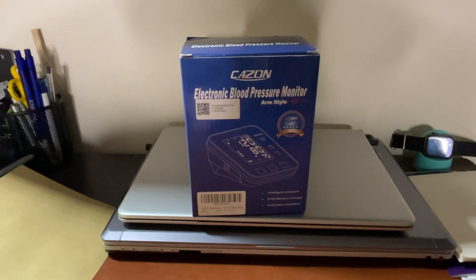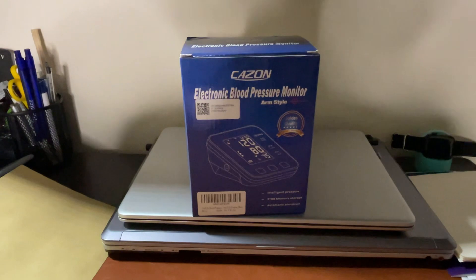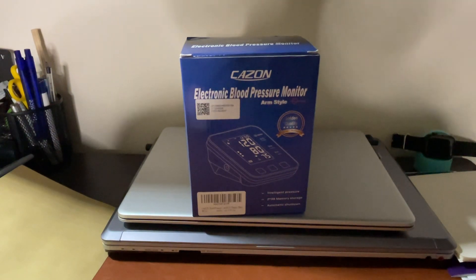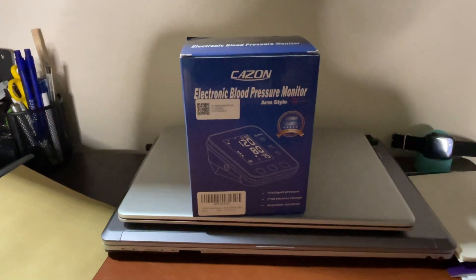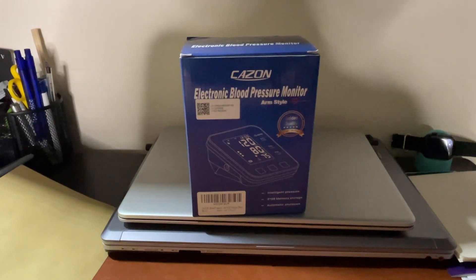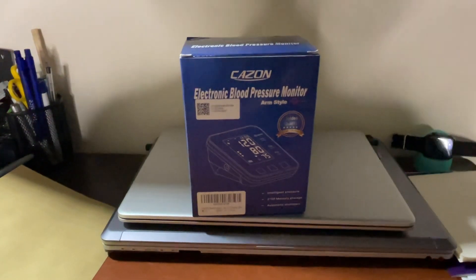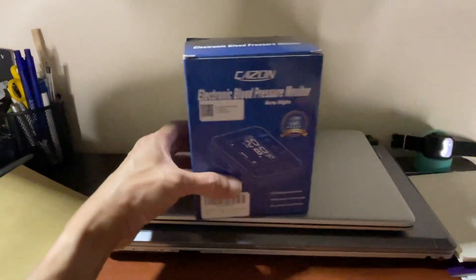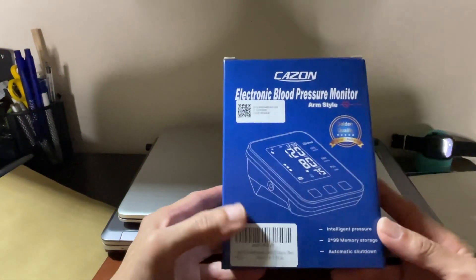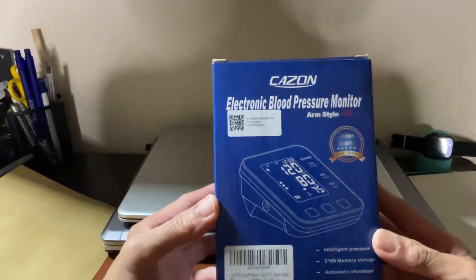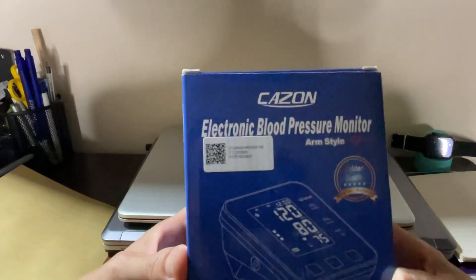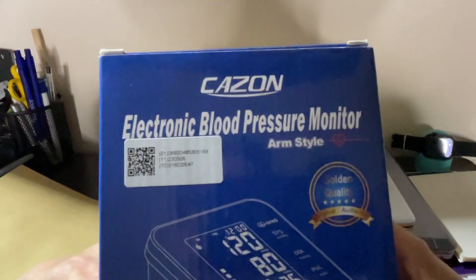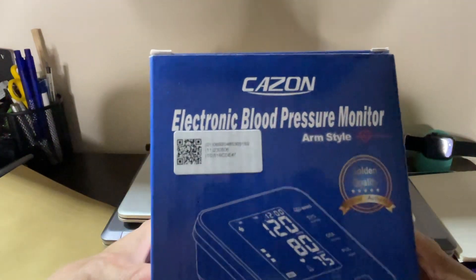Hi, it's me again. Good evening. Today is 27th of July 2023 and we're just going to unbox this electronic blood pressure monitor. The brand is Cazon.